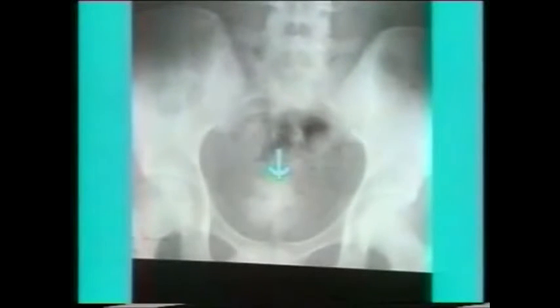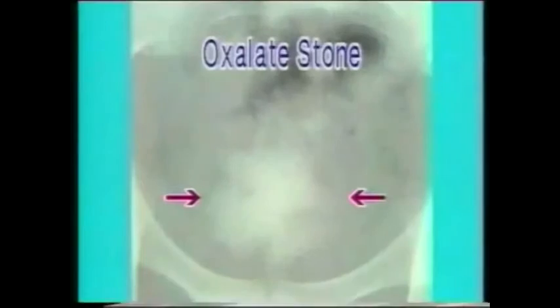This is another bladder stone with a spiky margin — an oxalate stone. It has very large spikes.